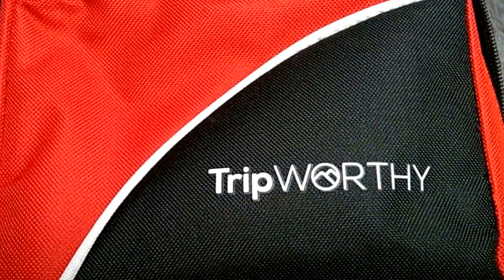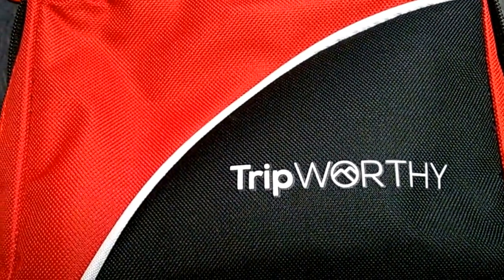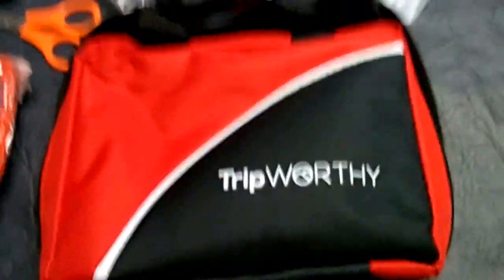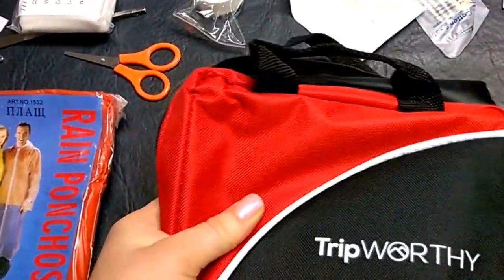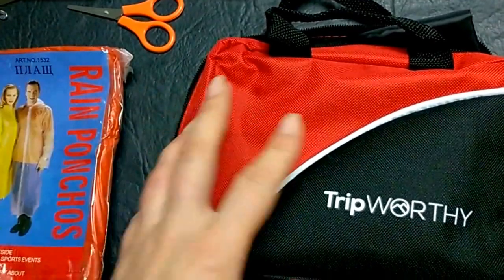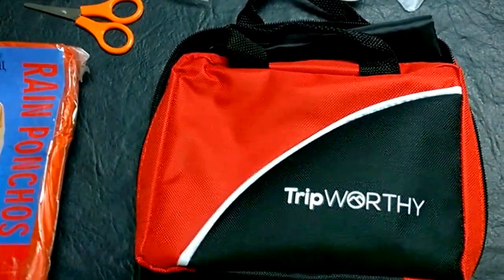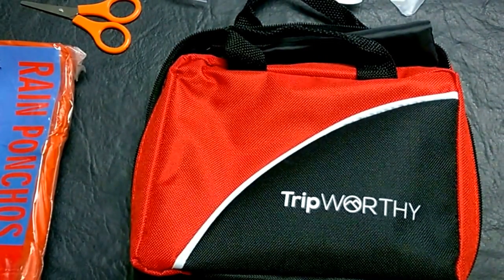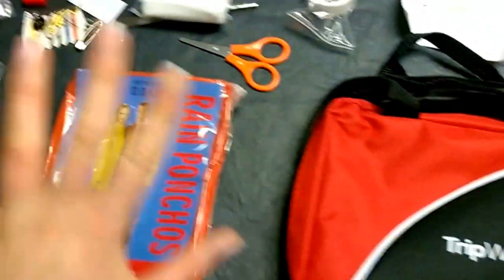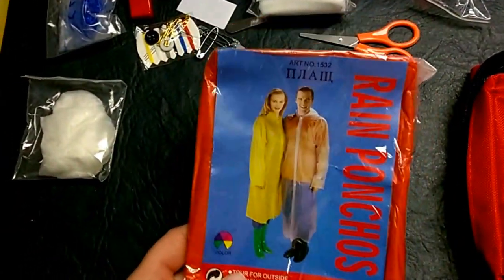Hello, this is the Honey Badger here with another review. Today I'm reviewing Trip Worthy's 100-piece first aid kit. I like this first aid kit — not only because I'm accident prone, but because it's small and has everything you need. This is probably one I'm going to put in my car, because it has all these extra features that normal first aid kits don't have.